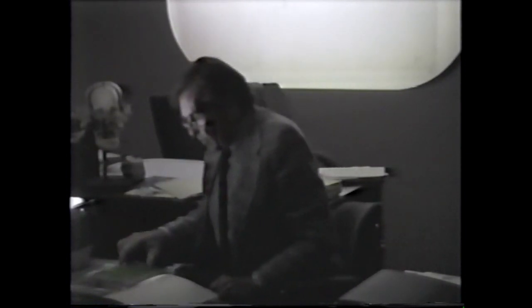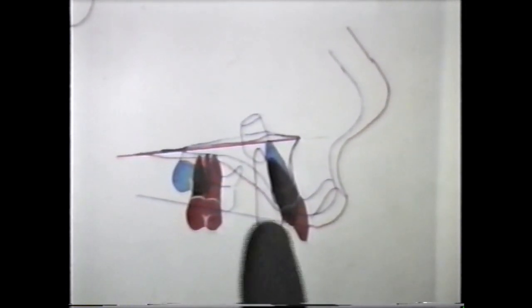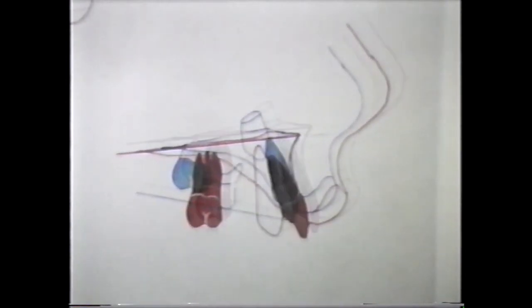And it's exactly 25. So that pretty well confirms what we've been saying for the last 20 years. But the closure of the facial axis is a little bit more than what our previous ideas were. And we notice that the A point comes forward just a tiny bit. So with the forward growth of the mandible, it looks as though the whole thing has been invited to come forward just a tiny bit. But just as we found in the other sample, the upper denture migrates forward on the maxillary base.